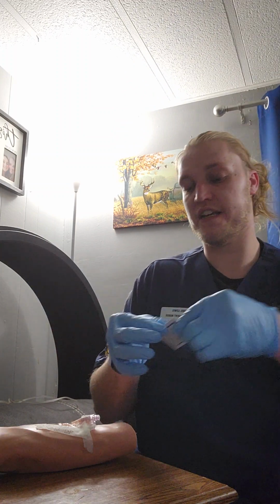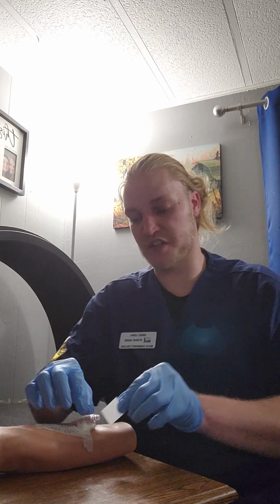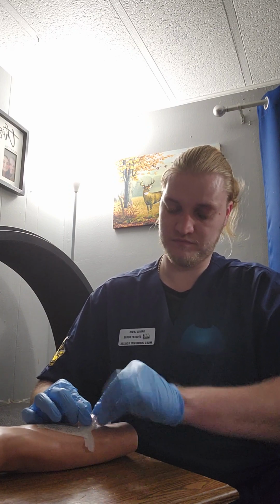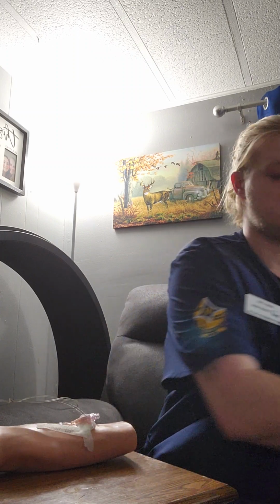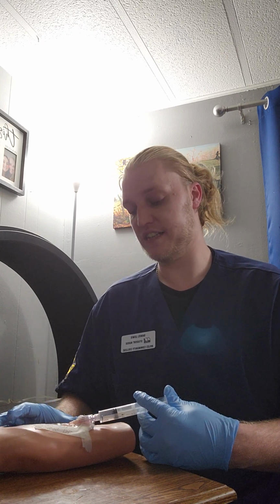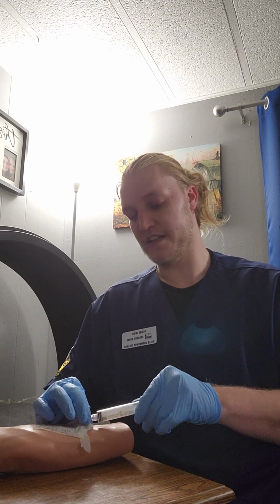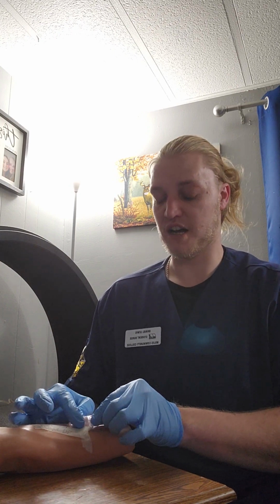I'm going to open an alcohol wipe and clean the saline lock so I can flush it with saline. Alright, I already have a 5 ml saline flush here, so I'm going to flush with all 5 milliliters of saline. At this point, I would put on a cap, the little antiseptic green caps that they have to keep this sterile.